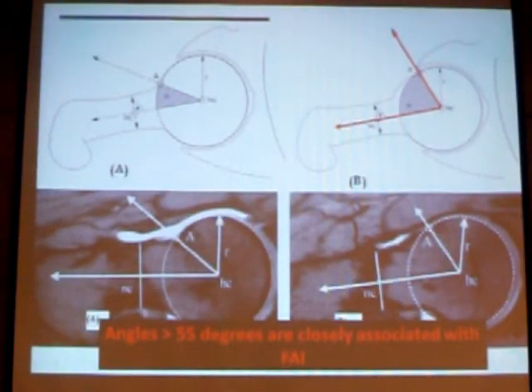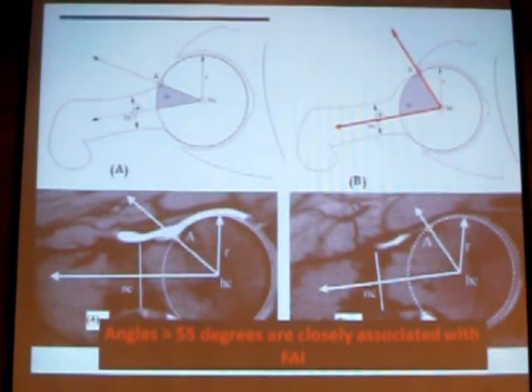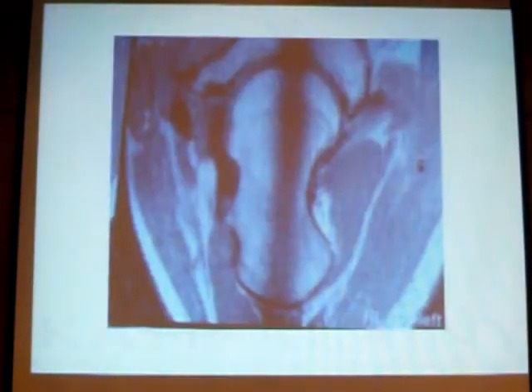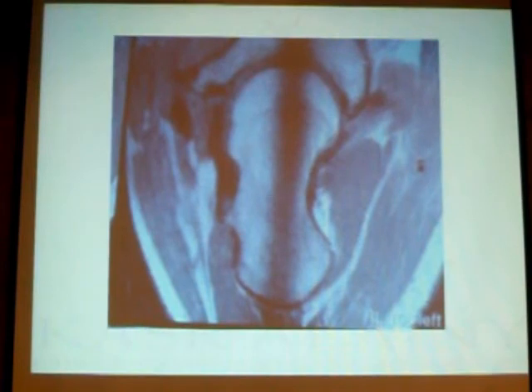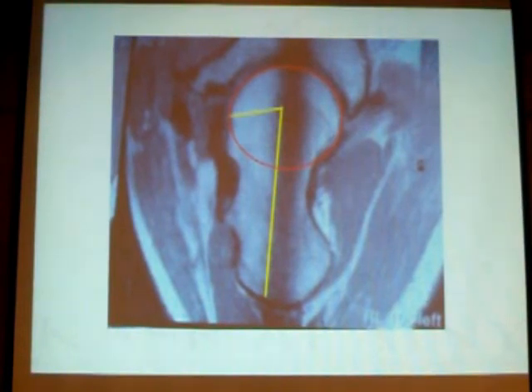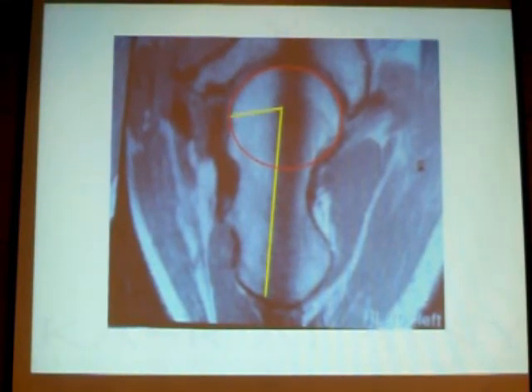The MRI allows us to use the alpha angle, which was suggested by Nötzli, and is positive if it is more than 55 degrees in any cut, corresponding to femoro-acetabular impingement. So if we take the cut here and look at the alpha angle, we find it is more than 90 degrees. The alpha angle is measured by drawing a circle around the femoral head, then a line from the center of the neck, and another line to the point where the head exits the circle. At this cut, the angle is almost 90 degrees.